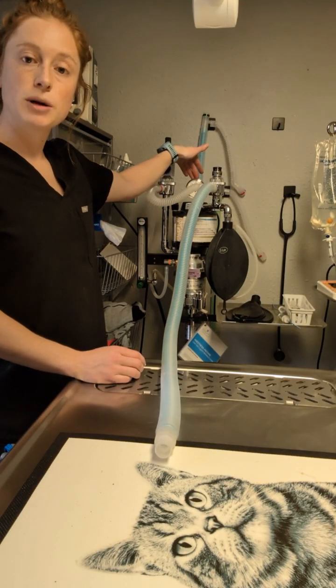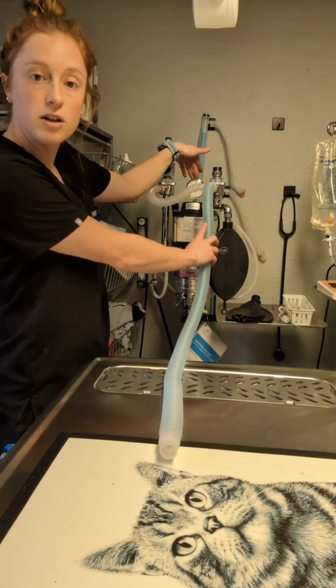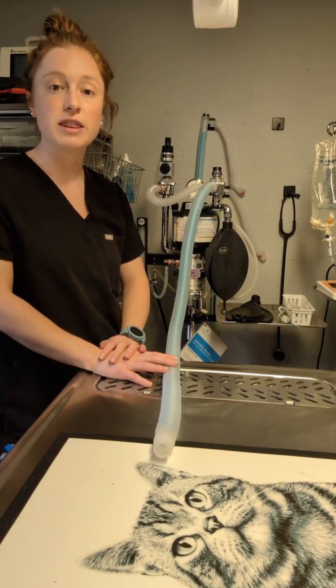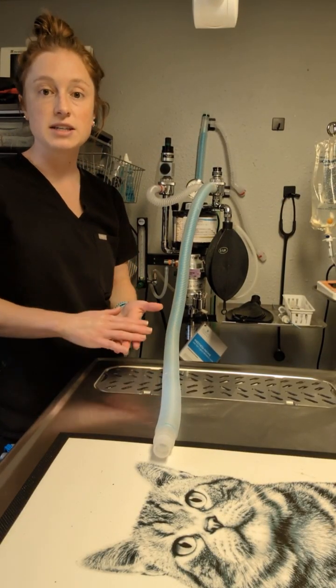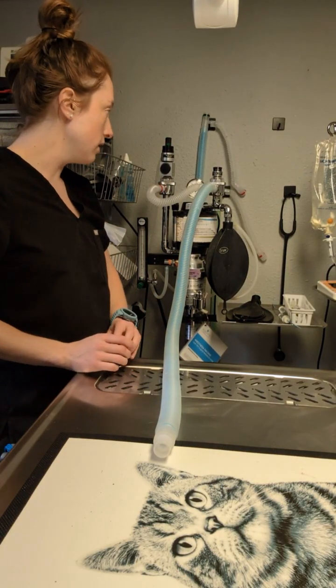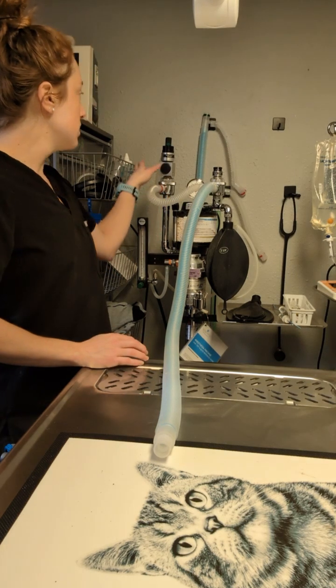We have our pressure manometer back here as well. This does tell us how much pressure is in the system. We want to make sure we're monitoring that when we're doing leak tests or anything like that. We don't want the pressure to exceed 20. So we'll keep an eye on that.